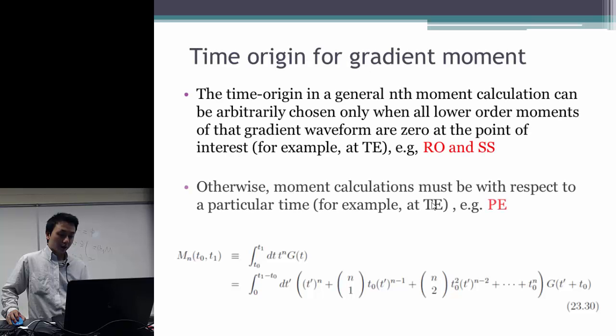So before we talk about the flow compensation along the phase encoding direction, we need to understand the calculation of the gradient moment, especially with its time origin.